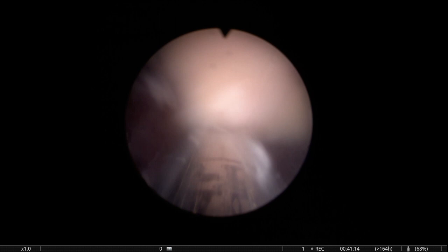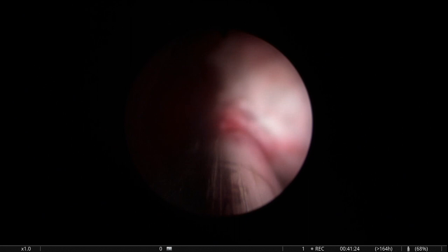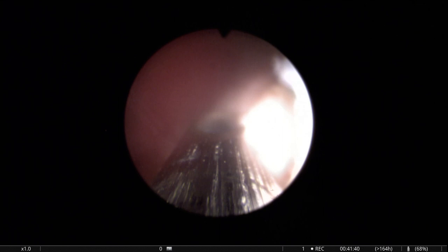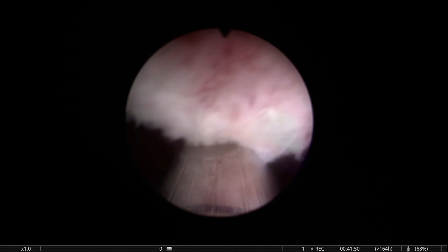Morcellation is very efficient now, so this is a big, big advantage, and it allows us to take out tissue very, very fast. So it's no longer a painstaking process where you had to wait and you couldn't see, and then you had to go in and coagulate again and empty the bladder, fill it up again, which was time consuming and exhausting for the surgeon and the personnel around the surgeon. It's now much easier, much nicer, much faster. And it really changes the picture a lot.